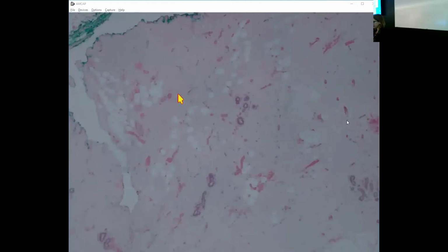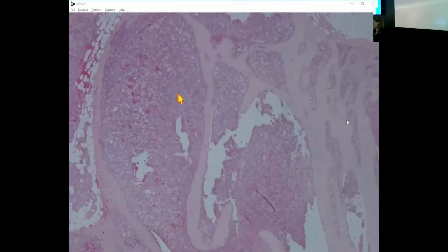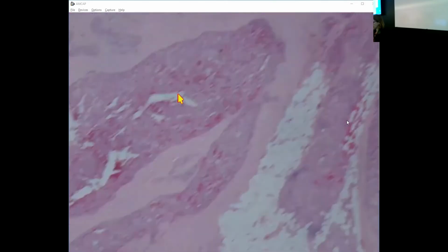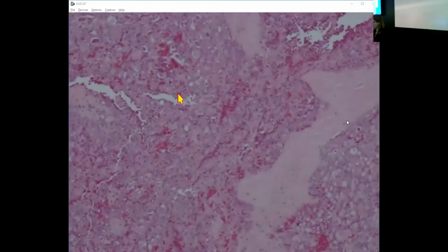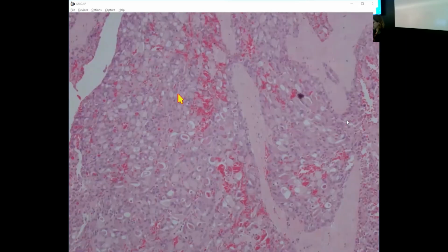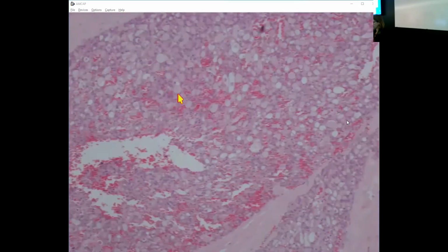Returning to our other case that I was going to show you. We discussed this on one of our core needle biopsies, and you can see how, if you just had a core biopsy through this entity, it could look like apocrine adenosis or atypical apocrine adenosis. I can very easily see that now. And this, does anybody want to hazard a guess? Yeah, this is secretory carcinoma.